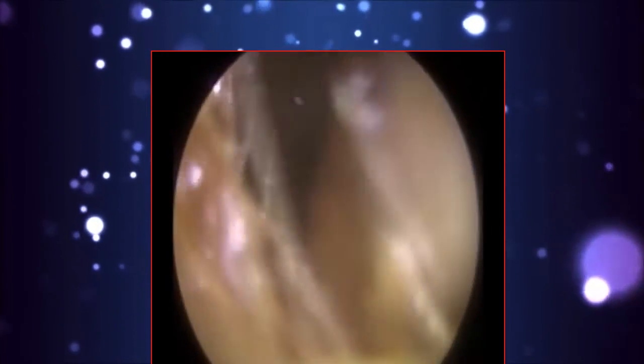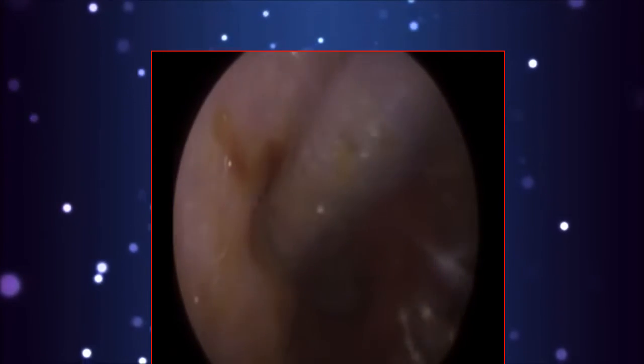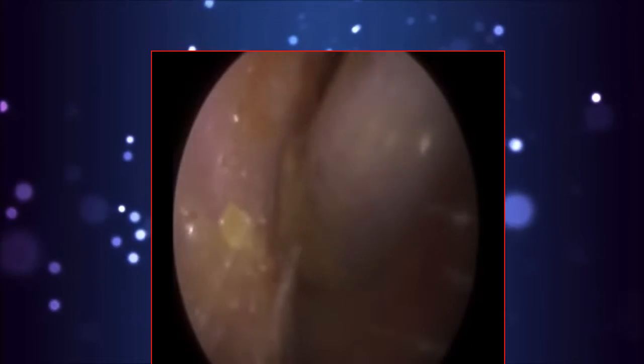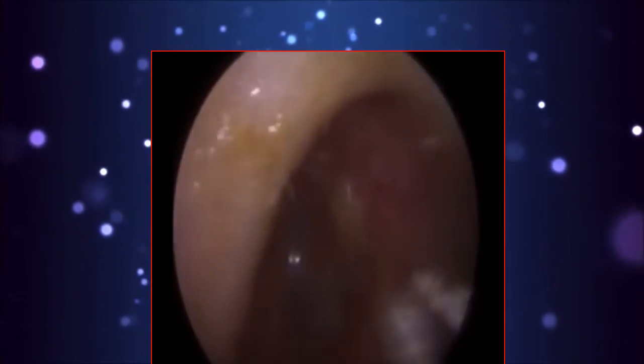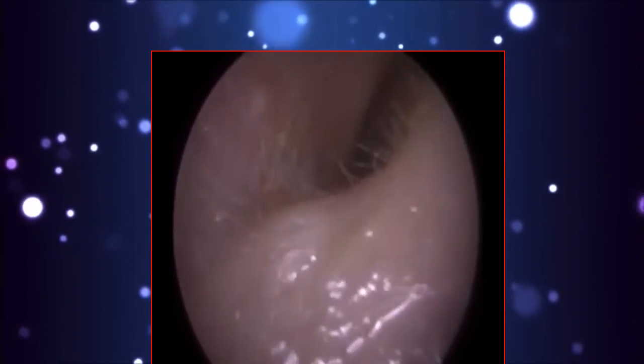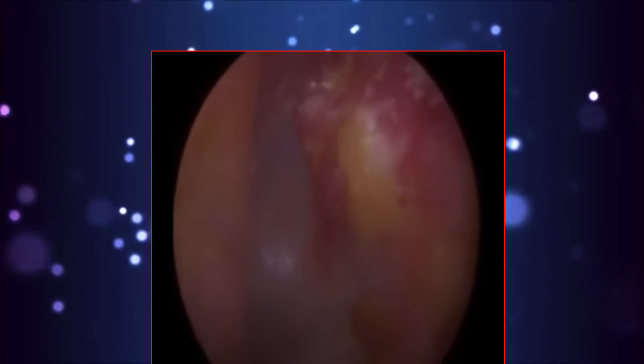Again, I'm just mopping up near the entrance. All this is not really going to improve the patient's hearing per se, but it's right lateral, so it's on the cartilage portion of the ear canal, so I can put a bit of pressure against it. If we were doing this on the inner 2/3 of the ear canal, so before you saw I was delicately and gently removing some dead keratin off the canal wall, that was more on the bony part. We wouldn't be able to remove that in the same way. I just removed this lateral piece of wax.